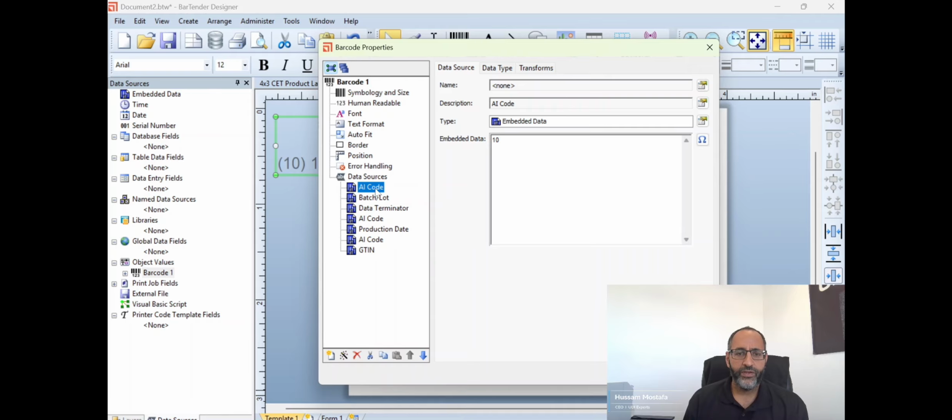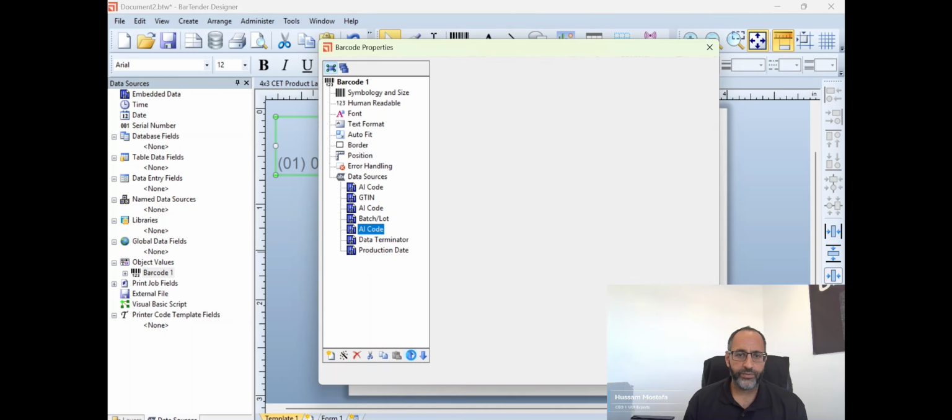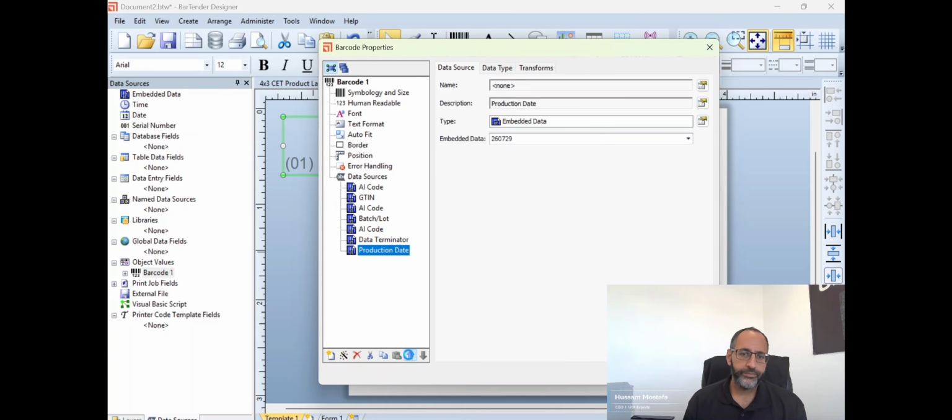All right, so we could arrange this so that we have the GTIN as the first one. So for the AI code, I'm going to go ahead and put this up all the way at the top. And then we'll bring the GTIN up. Okay, so now we have the GTIN. Next one will be lot. It matches. The application identifier is 10. So we have that. Here's the batch, 1, 2, 3, 4, 5. So that's good. This is 11 for the production date. And so we have that. But I'm going to put this up above the data terminator. So put that up and then bring the production date up. All right, and then the last thing is the data terminator.